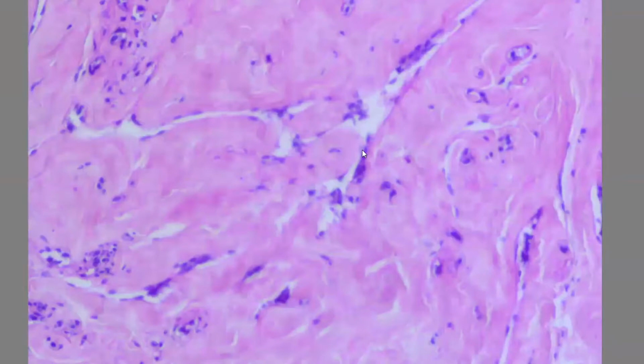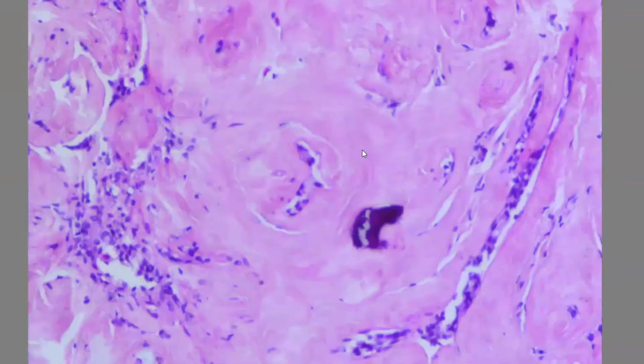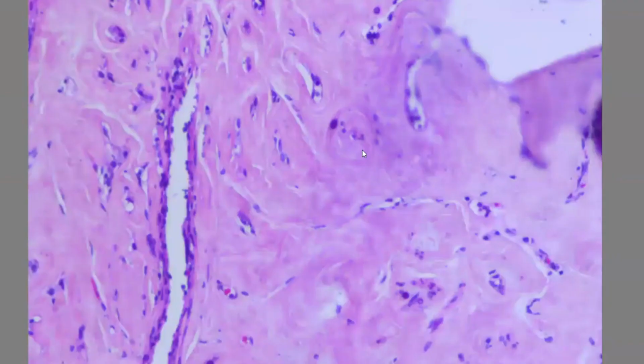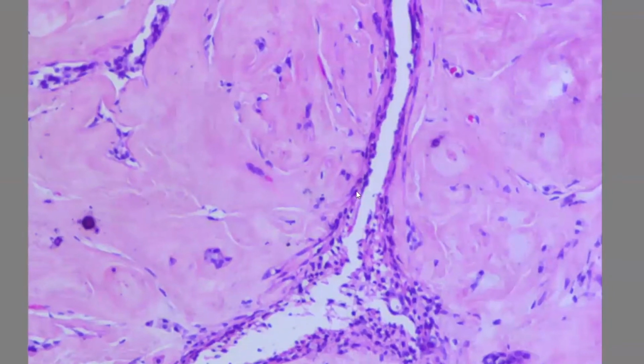Also for the glandular part, it's expected to see two layers of cells, the luminal cells and the myoepithelial cells, as this is again a benign lesion. I know it's hard to appreciate the two layers on this slide, but at least we cannot appreciate any malignant transformation or any atypical cells. And this is, again, the stromal proliferation surrounding the glands, making it look like this.